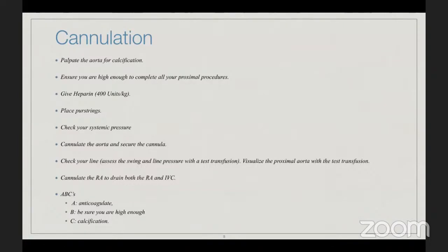Okay, good enough. So snares will not hold your cannula in place. They will only prevent leaking around your cannula. The tie you take around your cannula and your snares is the one that will secure your cannula in place and prevent dislodgement. Okay. And for more security, you fix it with another tie on the skin or elsewhere.